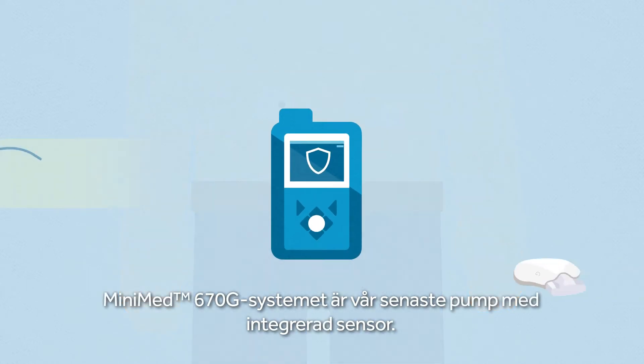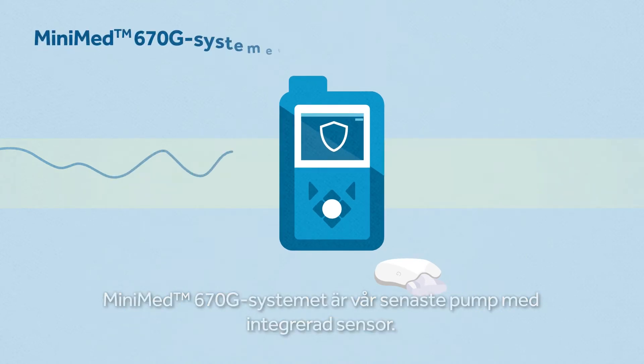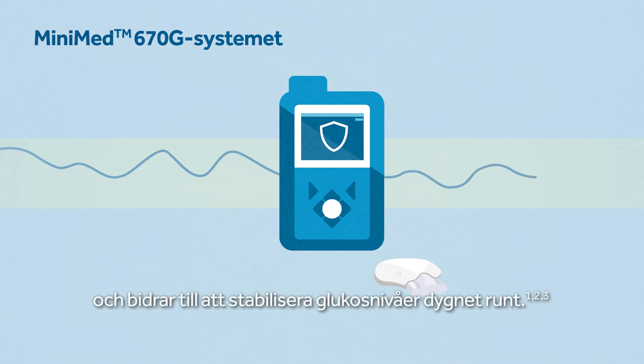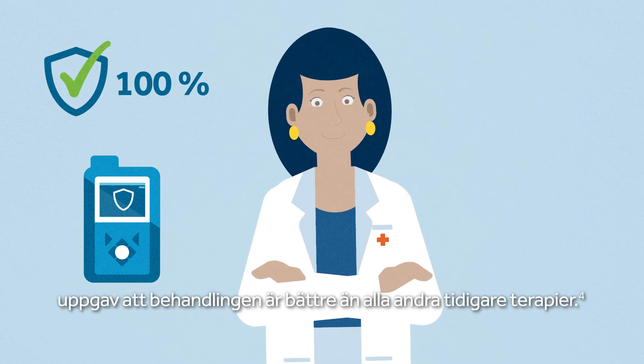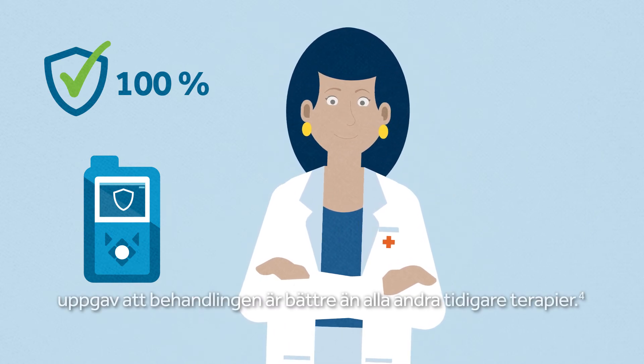Our latest sensor augmented pump is the MiniMed 670G system. It's the first ever to automatically adjust basal insulin delivery to help stabilize your glucose levels day and night. One hundred percent of healthcare providers whose patients used the MiniMed 670G system reported it was better than any previous therapy.